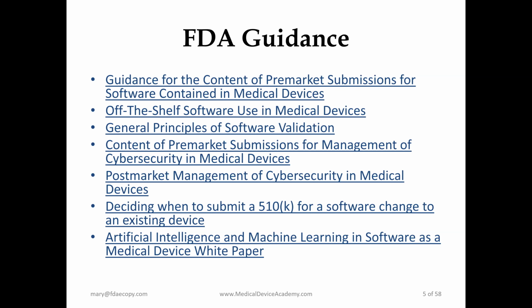The next is the general principles of software validation, which is an older guidance published by the FDA. Content of pre-market submissions for management of cybersecurity in medical devices goes over the cybersecurity documentation and information that you need to provide as part of your 510K. And then your post-market management of cybersecurity medical devices kind of covers more of your post-market surveillance plan with regard to cybersecurity. But as part of the 510K, they want to see what your plan is for managing cybersecurity. So that's when that guidance comes into play.